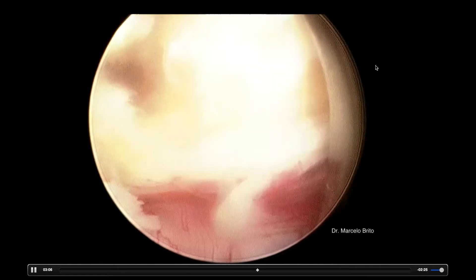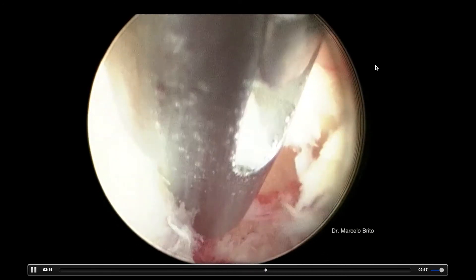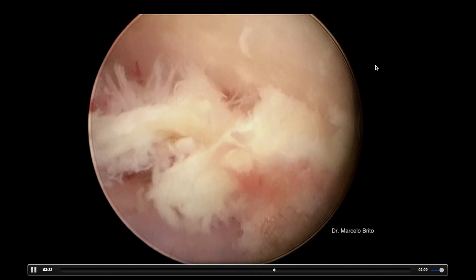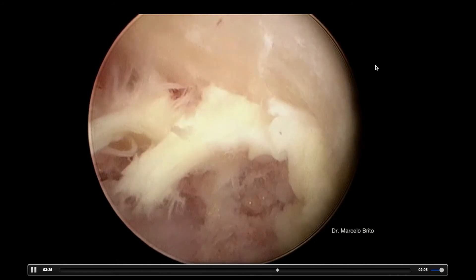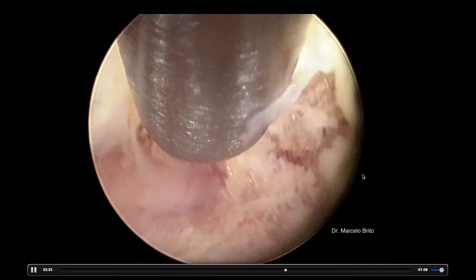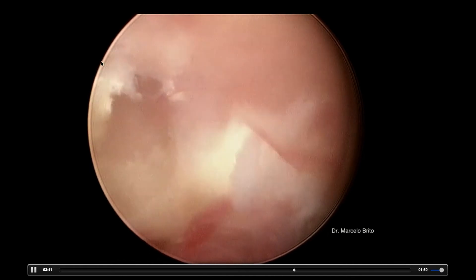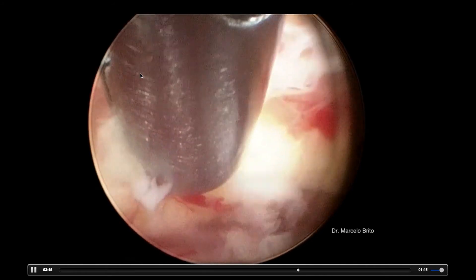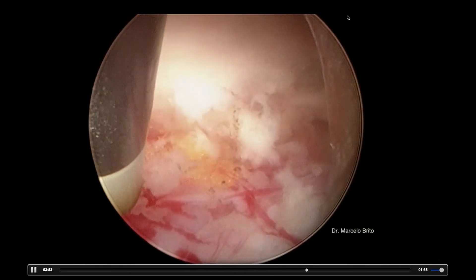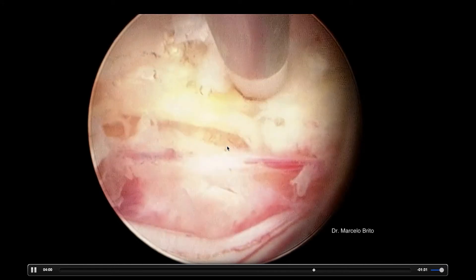We can divide structures and try to take the yellow ligament, leaving the dural sac untouched. Using the punch, the Kerrison, and the burr — you combine your instruments and you are working on the top of the canal, getting it decompressed. You're going to use a little bit more the punch, then change to the burr, and now you are seeing the facet joint on the contralateral side. We just take the yellow ligament and start taking it out, and now we reach the contralateral side — the left side. We are over the top of the canal and over the dural sac.